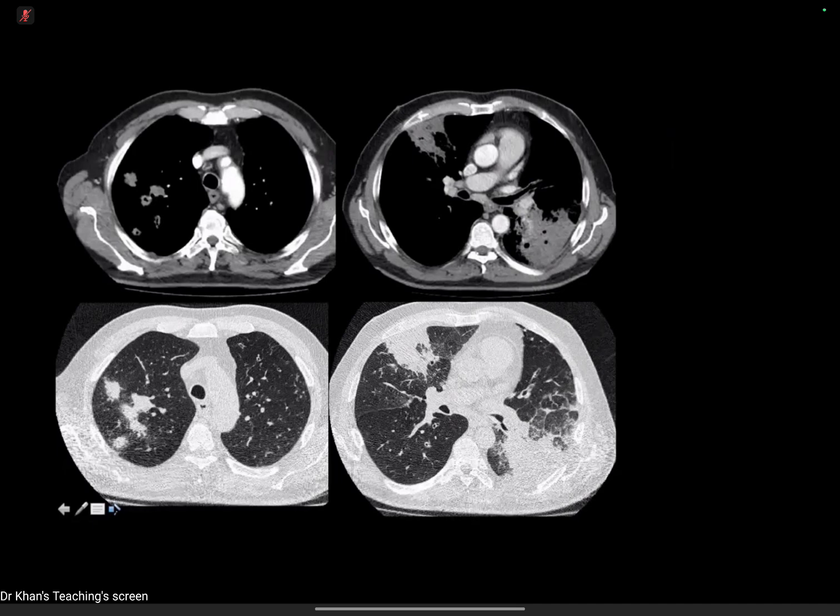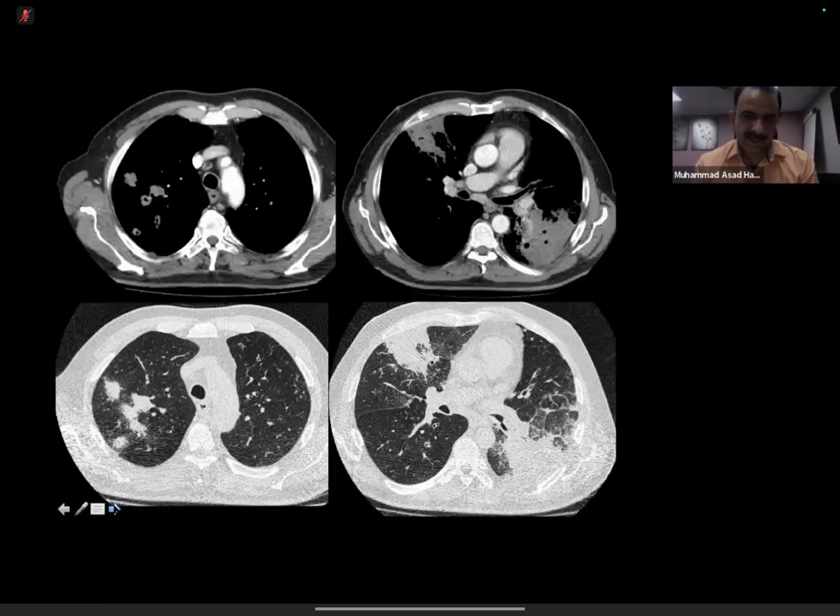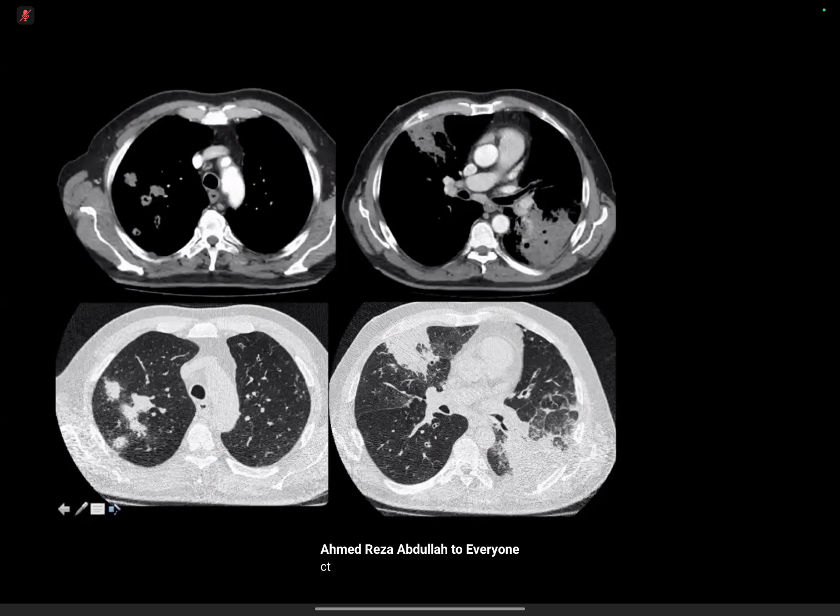So, although malignancy is probably the number one differential that has to be excluded, this could still represent multifocal dense consolidation within the lung from an inflammatory process. And one way to help determine would be to establish whether the visualized enlarged lymph nodes contain malignant tissue through potentially an endobronchial ultrasound biopsy. The deposits within the chest, within the lung itself, also look amenable to a percutaneous biopsy if that was desired. Good. Now, when you say percutaneous biopsy, which modality are you likely to choose? I would perform that under CT guidance.